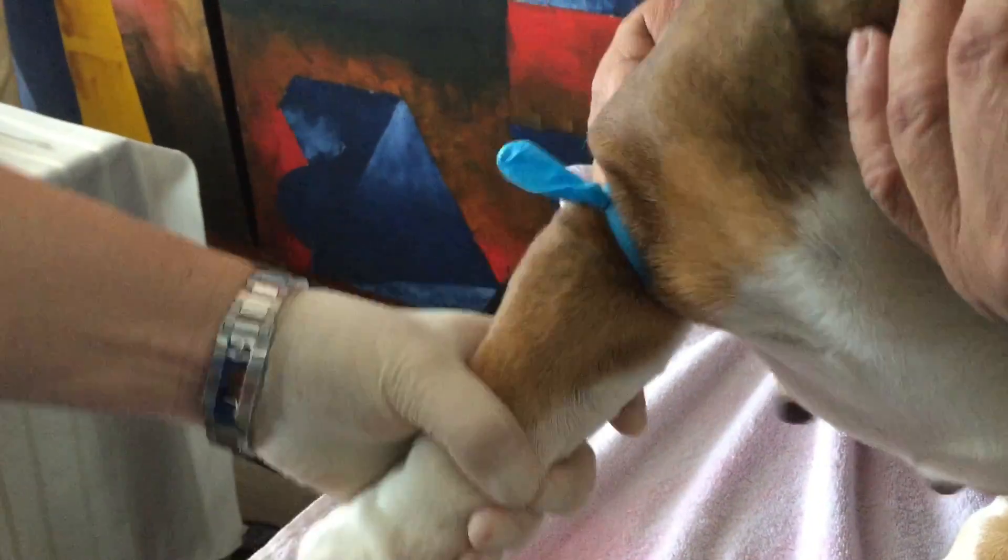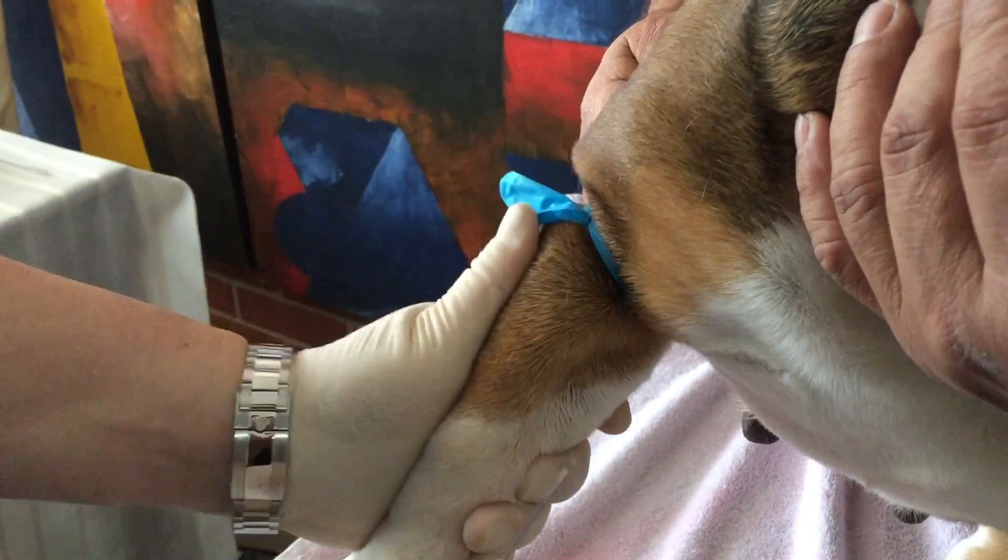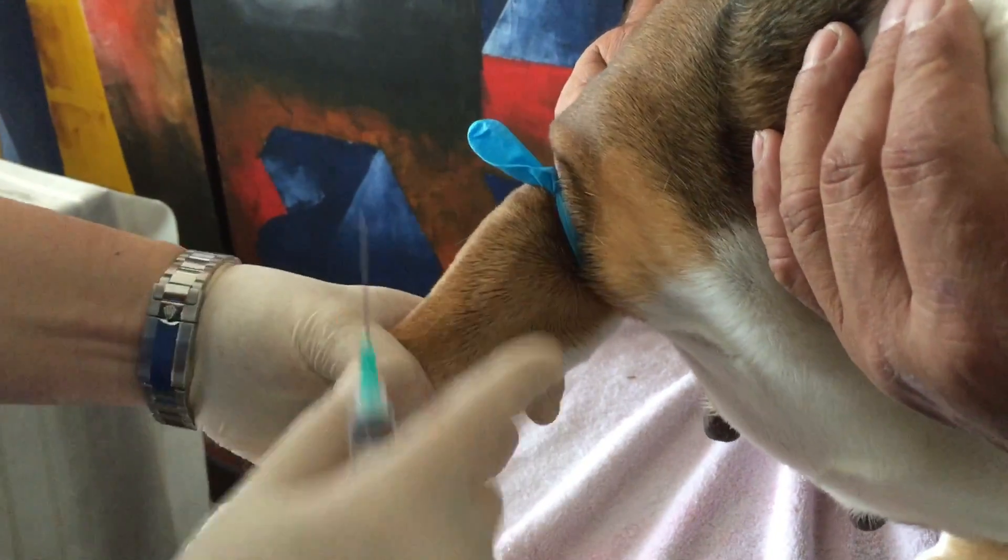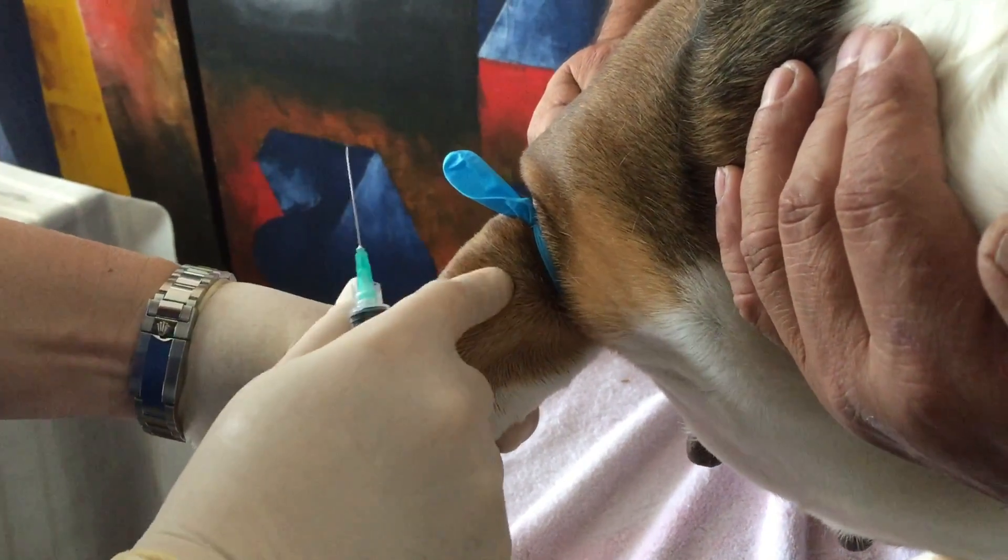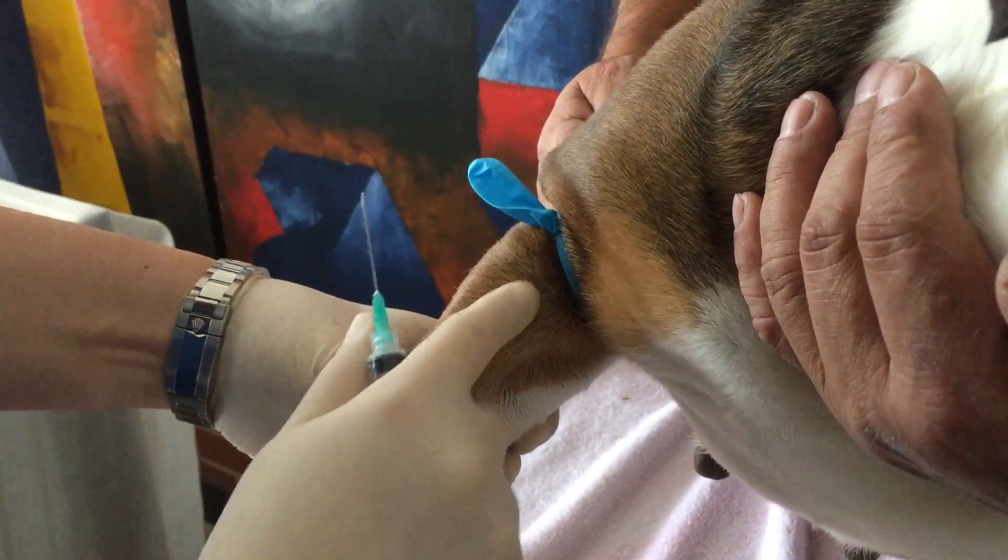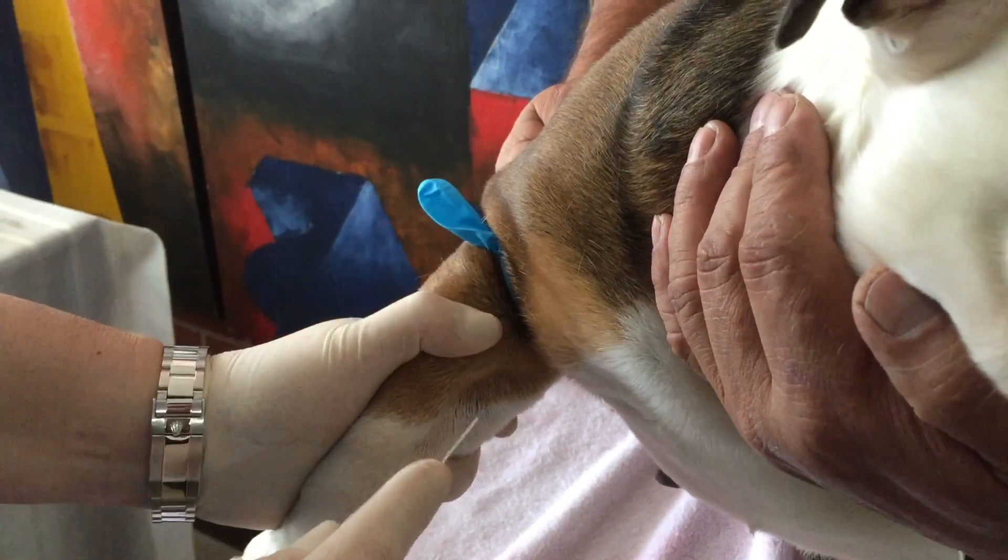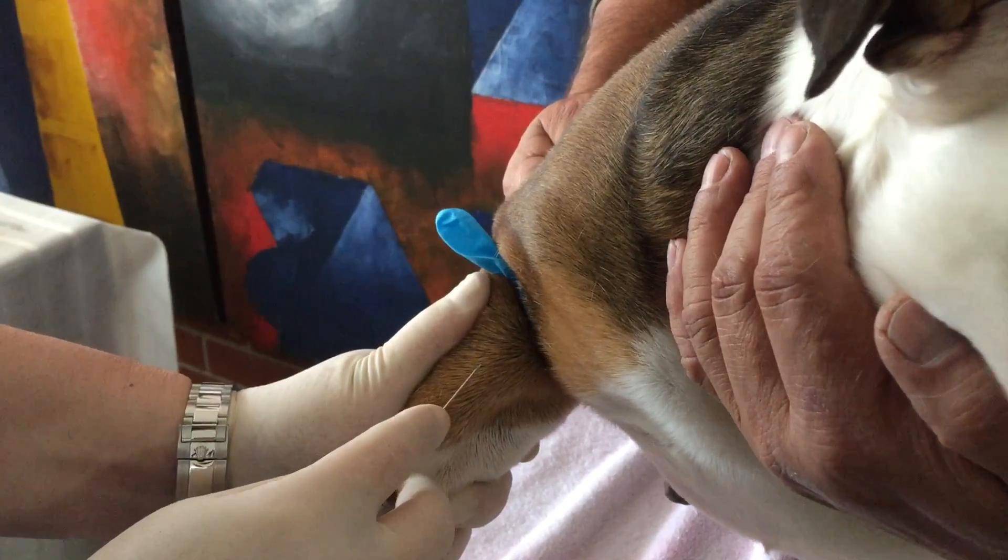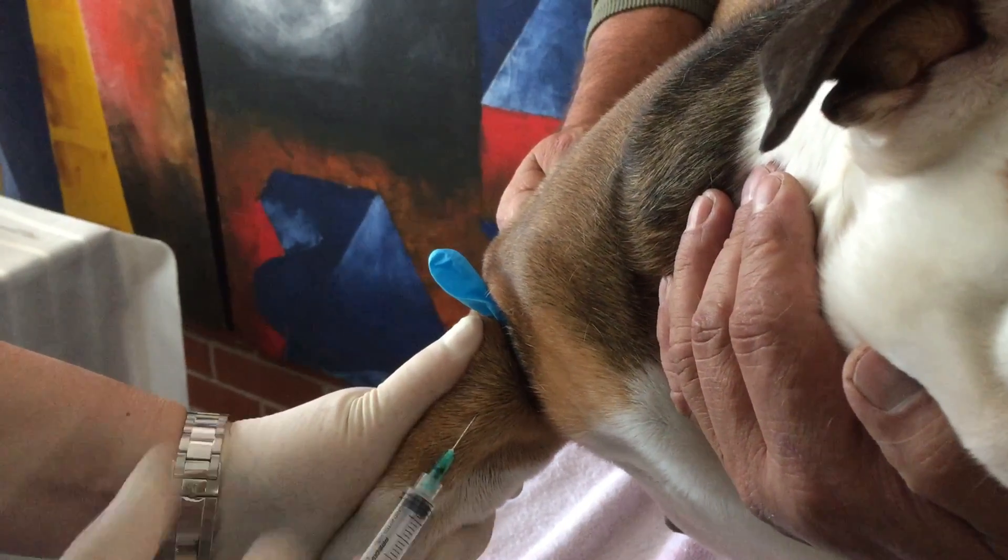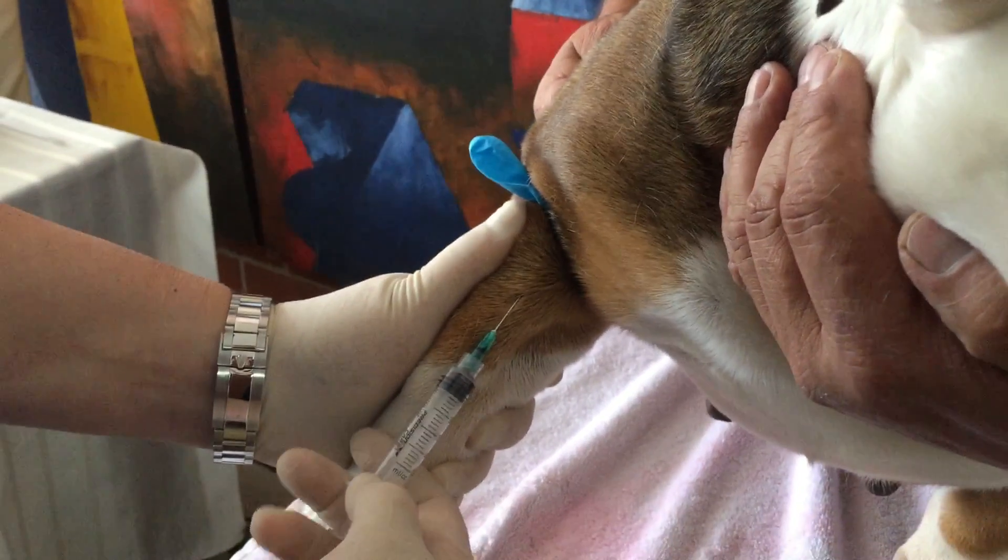You want the hole facing you. And you want to feel the vein. And some dogs, it's very hard because you can't even see them or feel them. But, practice makes perfect. So, when you feel it, all you do is you put in the tip until you see blood in the needle. And that's all you need to do.